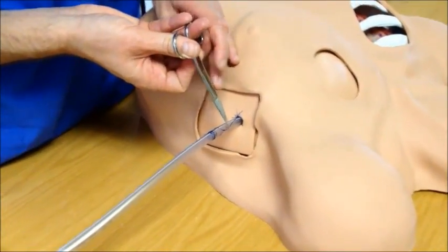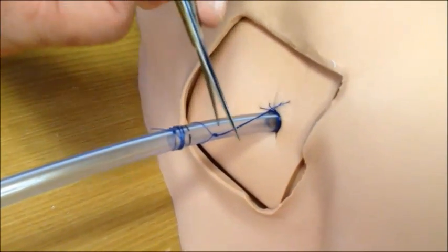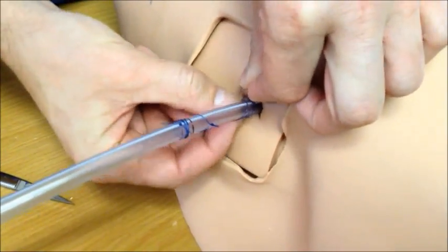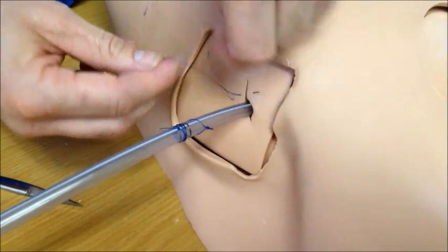you will now have two strings of that suture riding up from the wound up to the anchor suture. Simply cut them off. Feed the suture back through the loop that was created with your initial vertical mattress and remove it out. You can make the first throw of your tie at this time.